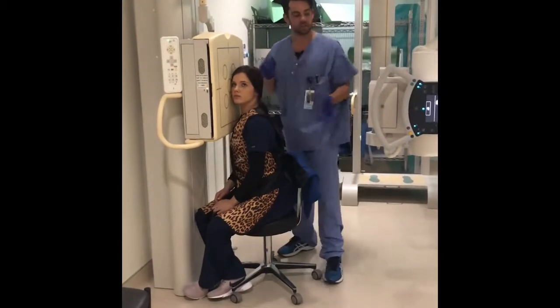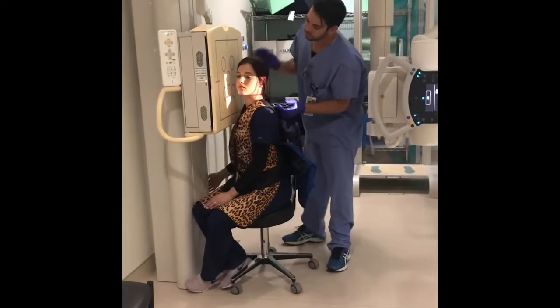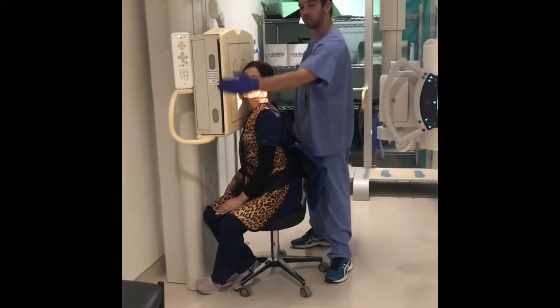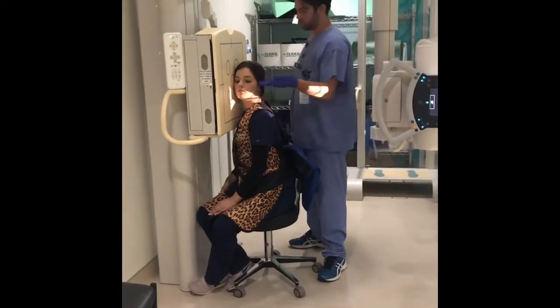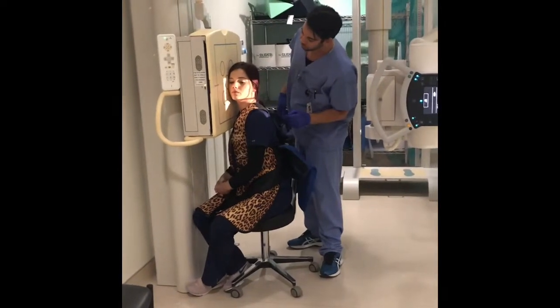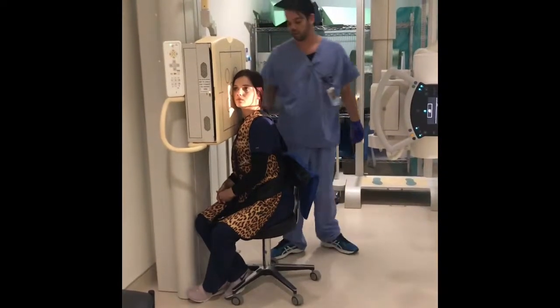For the lateral sinuses that show all 4, basically what we want is, we want her inferior orbital meatal line to be perpendicular with this edge of the IR. We want our interpupillary line to be just perfectly perpendicular with the IR, just like the CR. And we want our mid-sagittal plane to be parallel.